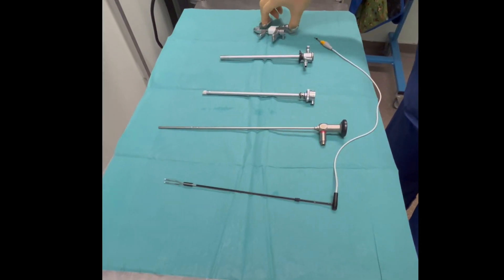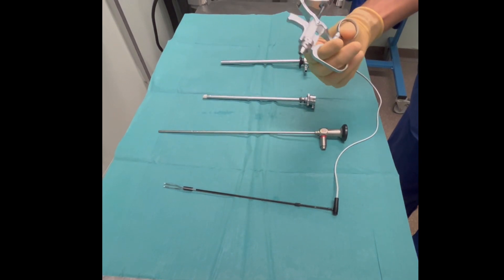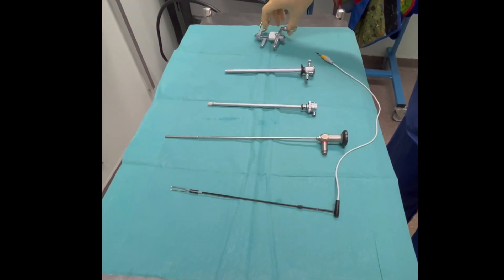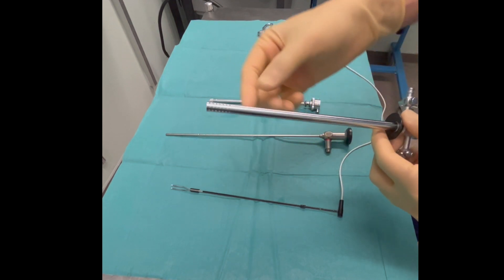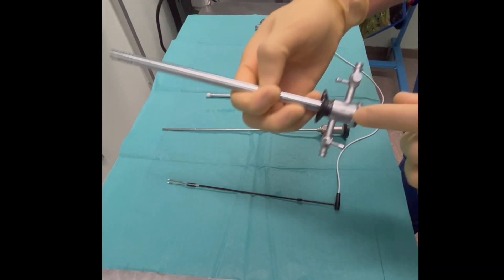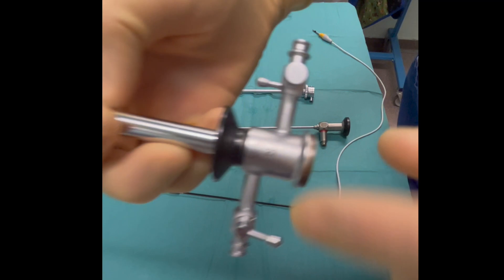This is a video demonstration on the VersaPoint bipolar resectoscopic system. It consists of five parts. The first is a handpiece, an outer sheet with outflow and inflow.